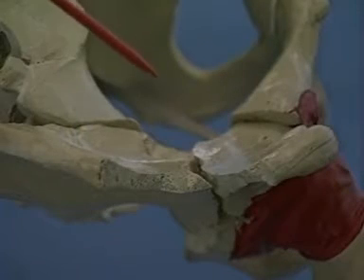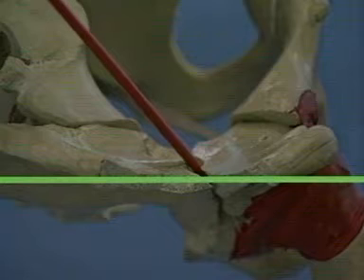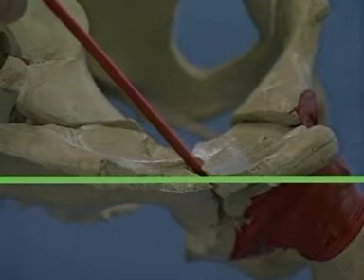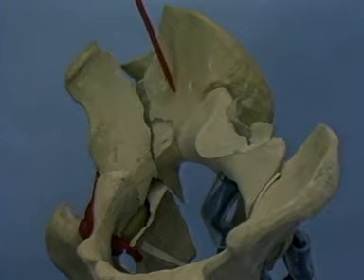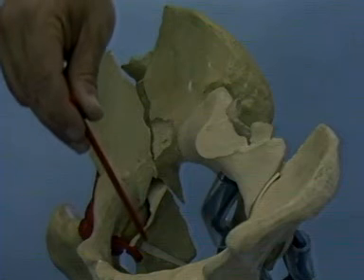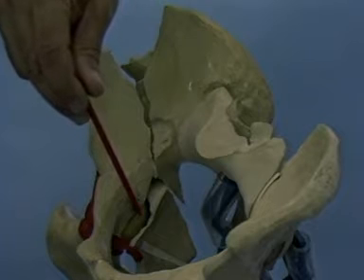The plane of the anterior column fracture as it traverses the ilium is typically oblique to the plane of the ilium and therefore makes a different pattern on the outside and inside of the bone. On the inside of the bone, we see the segments of the intact ilium, the anterior column, and the posterior column. The femoral head is visible, or at least in almost all cases palpable, through the split in the quadrilateral surface, which separates the anterior from the posterior column.